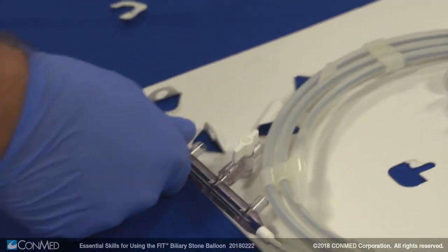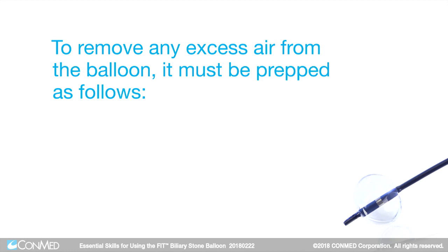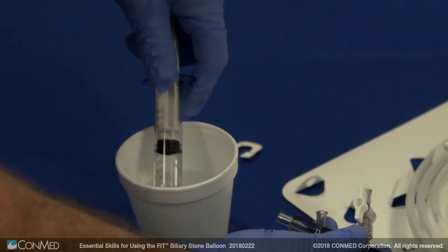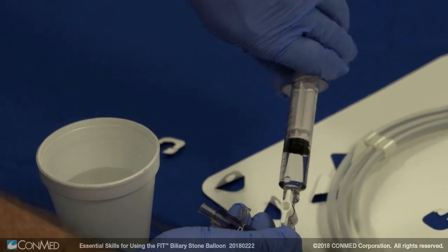Some users prefer to have the stopcock facing out. To remove any excess air from the balloon, it must be prepped as follows. First, fill the syringe with 4 to 6 milliliters of saline. Then, attach the syringe to the stopcock.